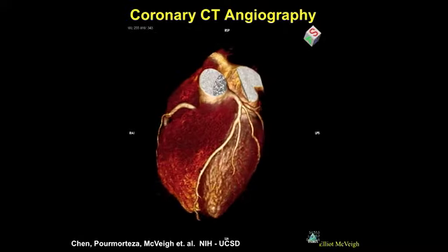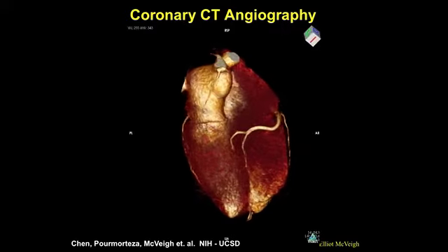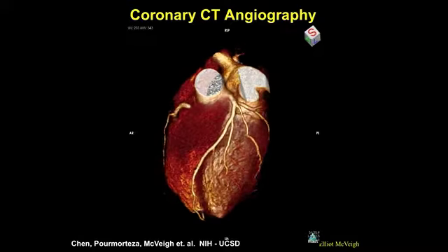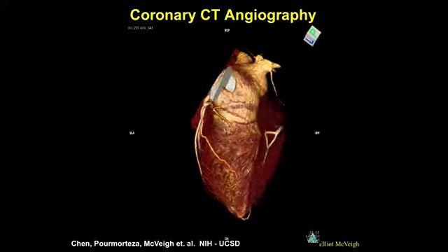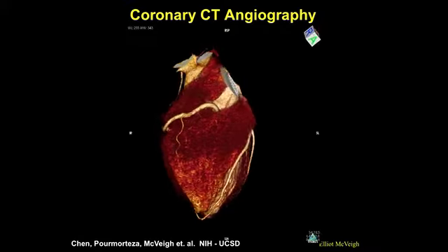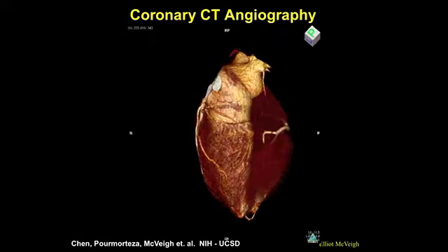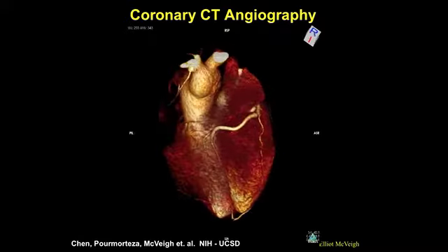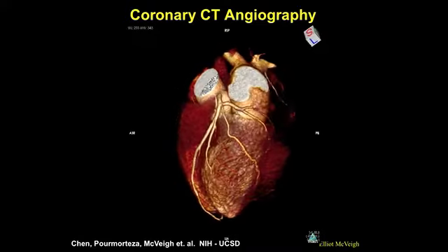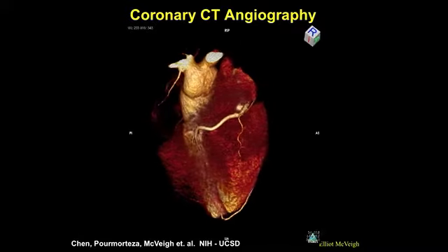So the other way, instead of slicing and dicing, is to look at all of the data together as a 3D volume. This volume is rendered using whatever your favorite 3D rendering software is. You can use RenderMan, you can use whatever the vendor gives you. Each voxel in space, if I have an XYZ coordinate, has a brightness, right? It's just a number, and that number is usually somewhere between -1,000 and 5,000 in CT for historical reasons.